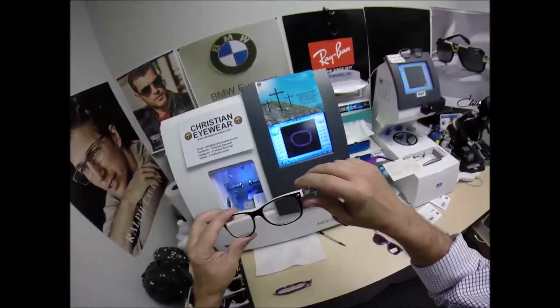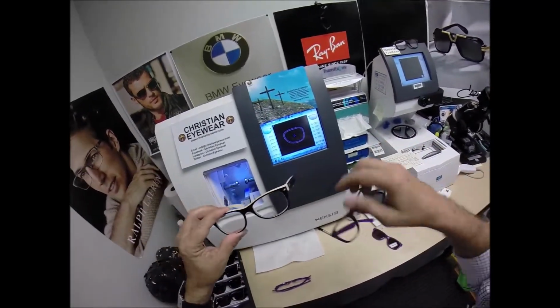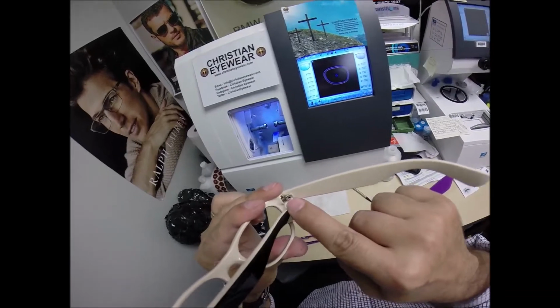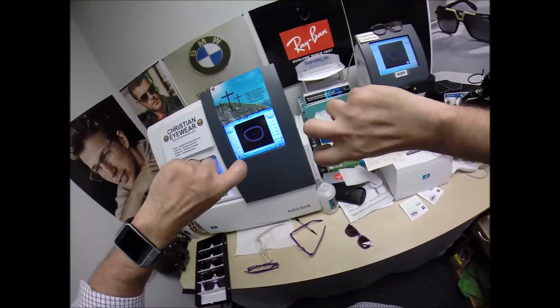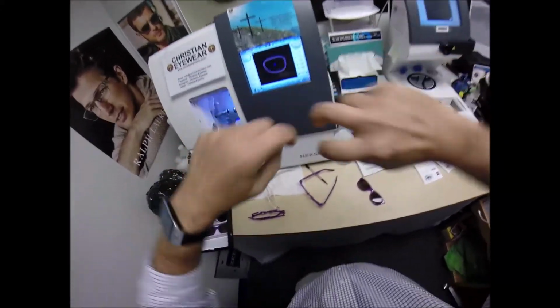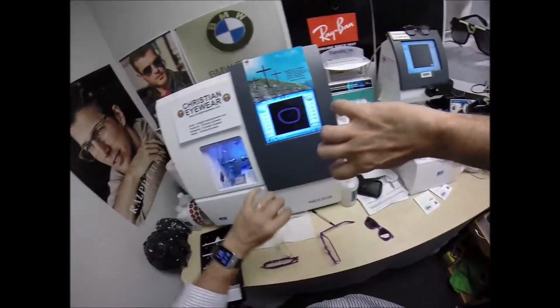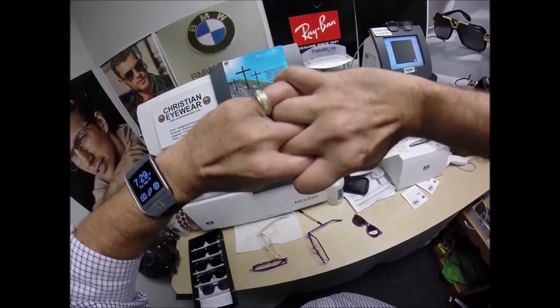Now, the one thing I did do, this is known as the shield. This is the rivet that goes through and holds the front of the hinge. I took that off of there because some people don't like that. The other thing I did is this has a 3-barrel hinge, meaning that on the temple there are 2 barrels, and one on the frame front. When those go together and the screw goes through it, you have 3 barrels. I went with a 7-barrel hinge. I wanted these to be really, really strong. 4 on the temple and 3 on the frame front. Oops. Put a square peg in a round hole, and that just makes it that much stronger.